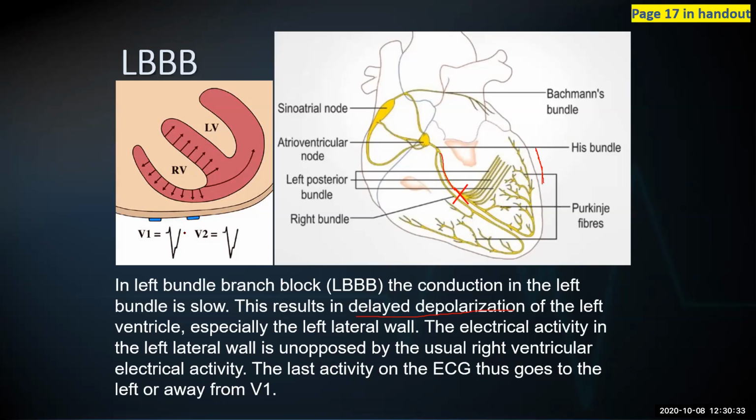So what happens is, you remember V1 is going to be, if I were to draw a person's chest here, and we have the heart's activity going from left to right, we know that V1 was on the right upper sternal border, the fourth intercostal space or so on the right side. So it should be that the electrical activity is going away from it, and it is. So it makes sense that V1 is going to overall be a negative deflection.